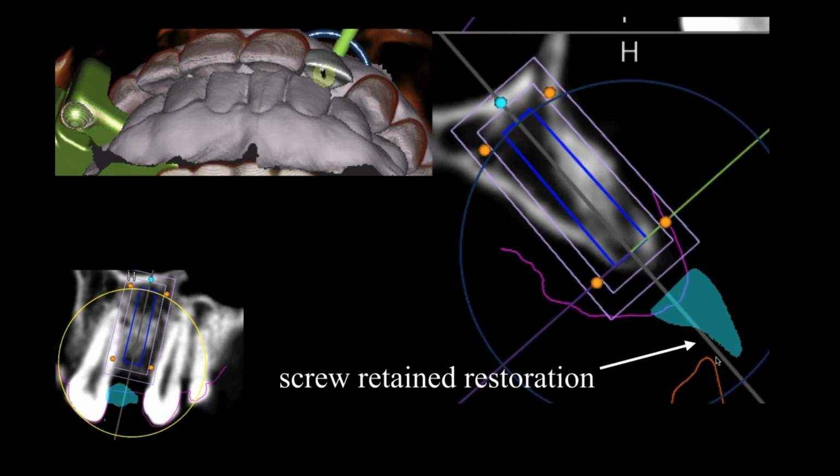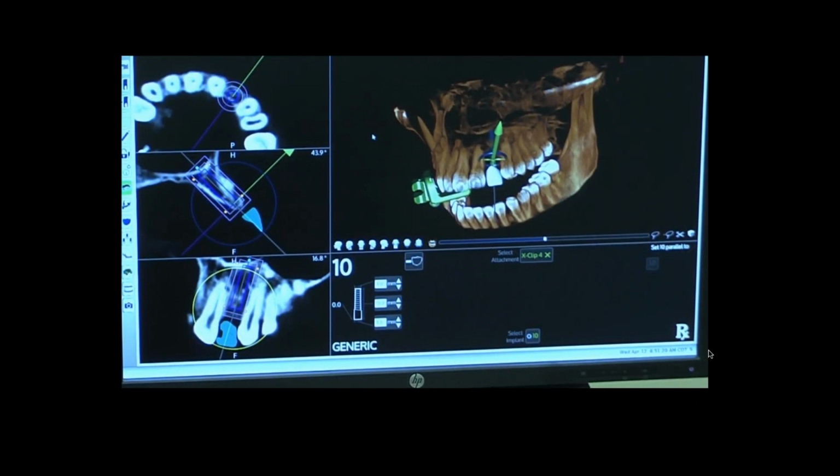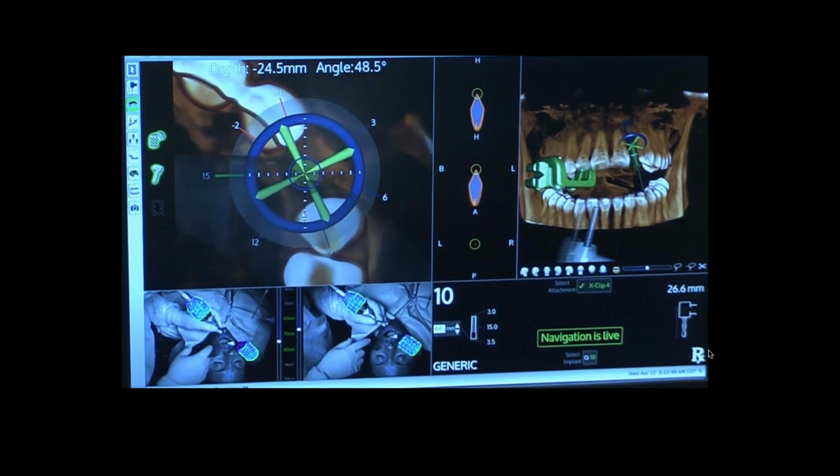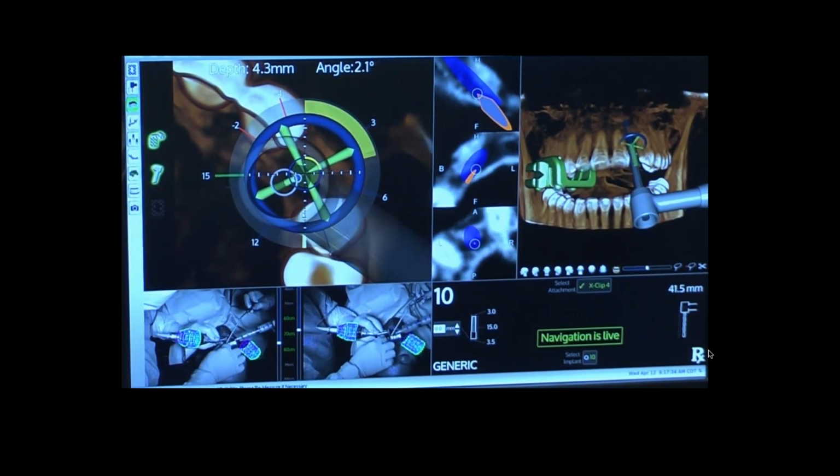So I used to look at people who told me that and say, sure, but I never did it. But now I can do this with, believe it or not, you can be 0.5 millimeter accurate on these. So here we are at surgery, and we're going to do the surgery. We calibrate the machine. We make sure the clip is right. So I'm making sure everything is lined up on the drill.